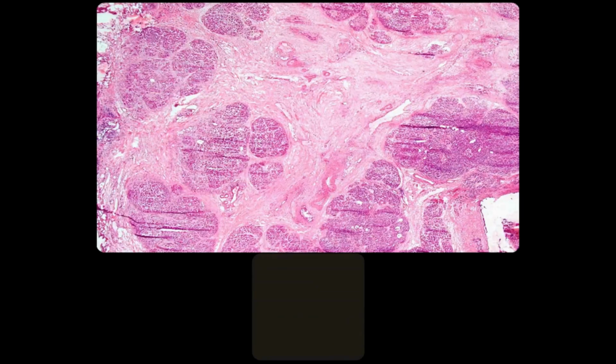And here is one where you have some islets and you have atrophic acinar tissue. But the essence here is the low power impression of lobularity. And you do not see single isolated ducts wandering around that are irregularly shaped. And under this magnification, it's chronic pancreatitis.